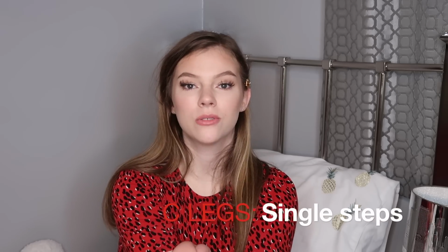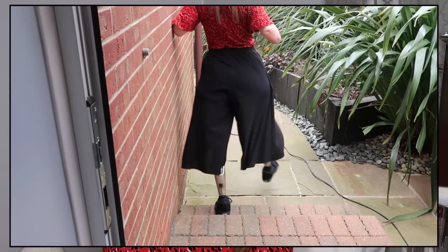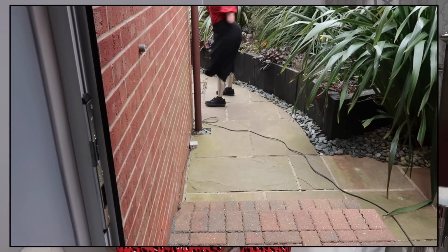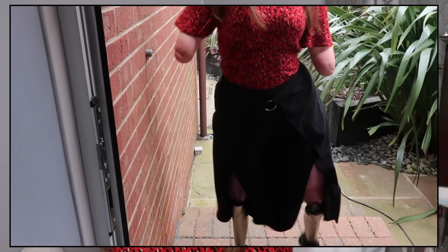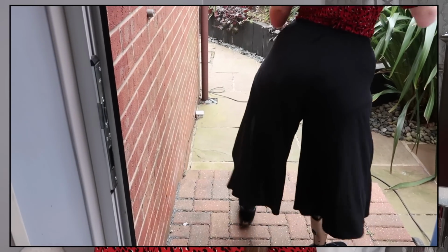Now, the last two are single steps up and down. These are still something that I'm a little bit wobbly on, depending on what the steps are. Obviously, it differs between different size steps, different environments. I may be confident at this size step at home when I'm by myself, but put me in front of 100 people and I can't do it. So I'll show you on our back two steps because we have two there. Luckily, I have the wall to hold onto there if I need to. Just a little confidence boost. But with steps like this, one or two steps, I don't follow any of the methods that I was taught. I just do it and then I'm like, oh, safe.